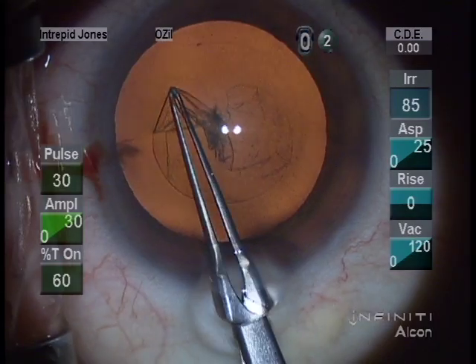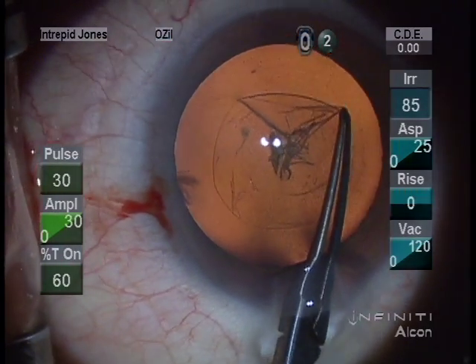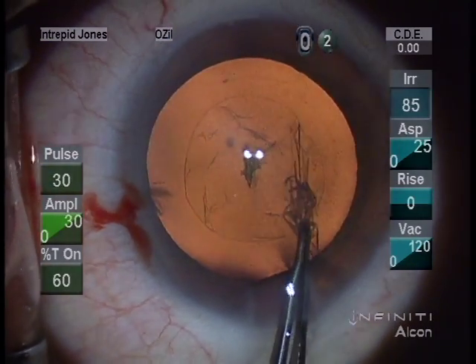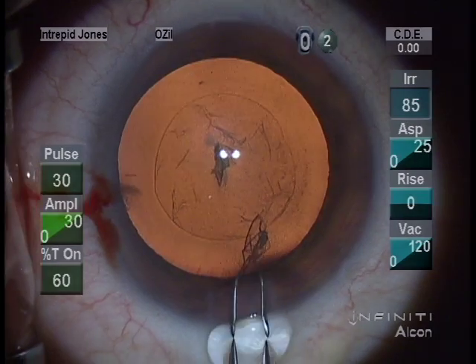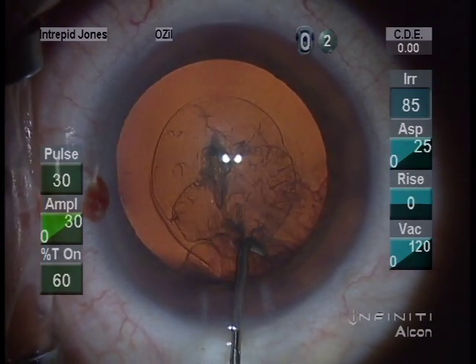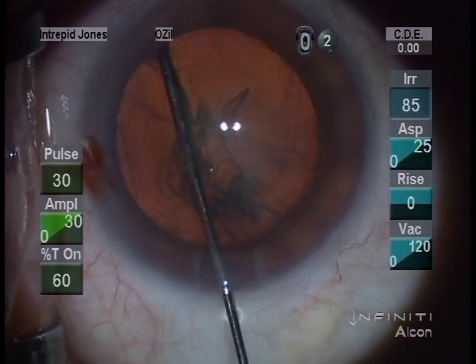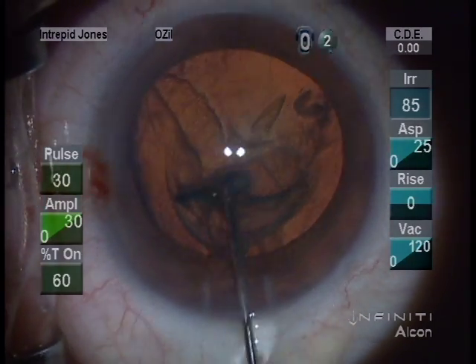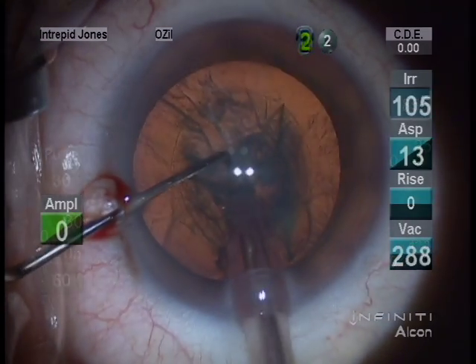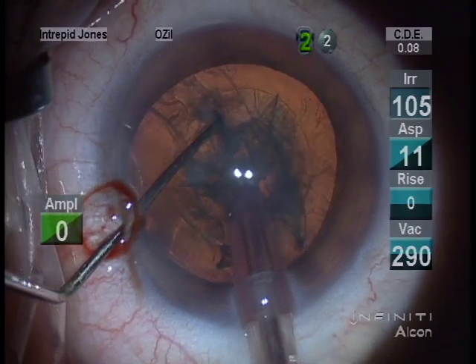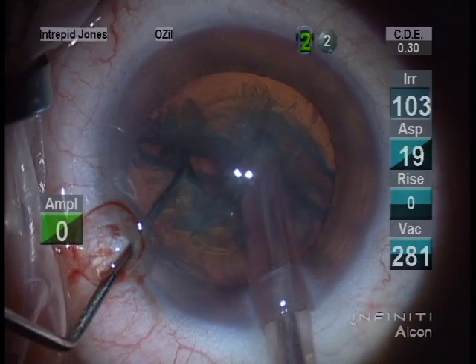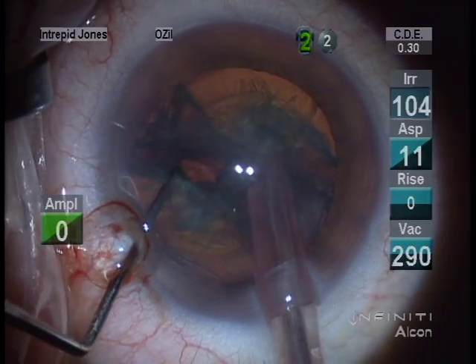The capsulorhexis is crucial as it is for any cataract surgery; however, in this case I want to ensure that I have a slightly smaller capsulotomy to ensure adequate overlap on the optic, should an endothelial transplant be contemplated in the future or a penetrating keratoplasty. I want to make sure the IOL is secure, and if a YAG has been performed, there is less chance of vitreous migration.